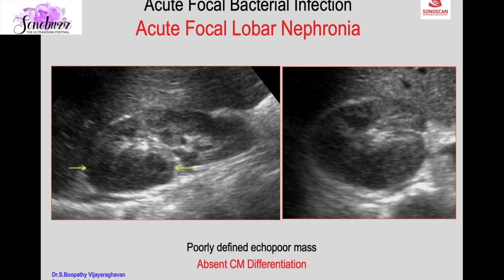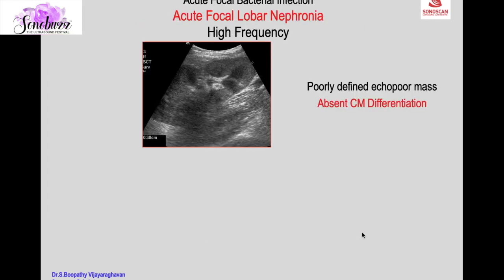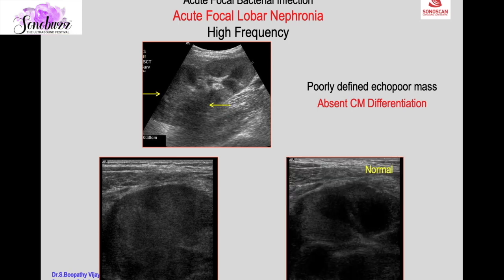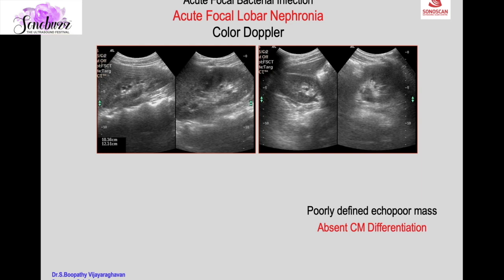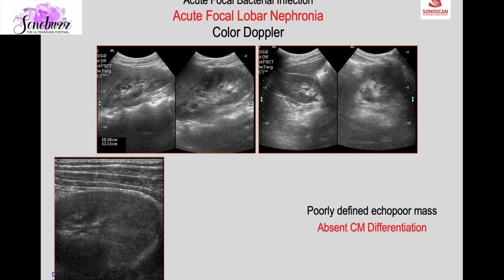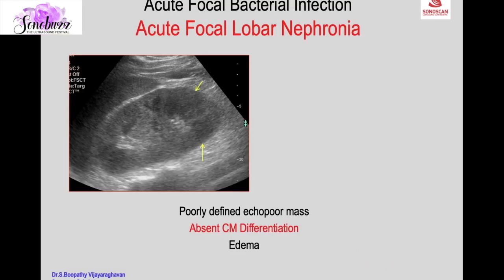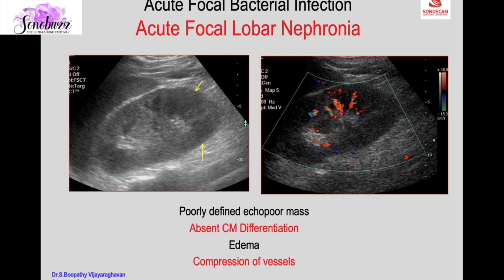Another case shows a poorly defined echo-poor mass with absent corticomedullary differentiation. Acute focal lobar nephronia is better appreciated on high-frequency scan — compared with the normal, you see changes in echogenicity and loss of corticomedullary differentiation. The medullary pyramids, normal in the healthy kidney, are not appreciated in acute focal lobar nephronia. On color Doppler, due to edema and compression of vessels, sparse or no vessels are seen in the ill-defined mass.